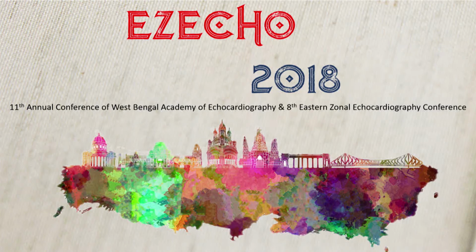Probably. So maybe since you can't do an MR, maybe consider a cardiac CT. That will show you nicely where the leaflet is, where the valve is, and it's actually a very good test to see if the valve leaflet is impinged. Here he was paced 10 years back, so it's unlikely that he has got an MRI compliant pacemaker. Doesn't matter, but a cardiac CT will show you. The only disadvantage of cardiac CT to get function, you cannot do a prospective gating. You'll have to do a retrospective, which gives him more radiation. But he's 79, so it's fine, right?